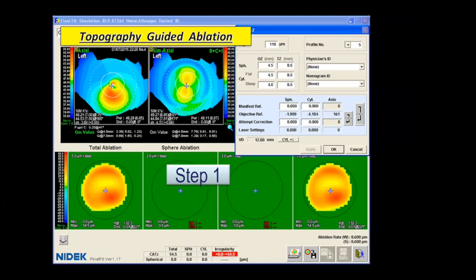But how do you measure it? I mean, before removal of the epithelium, when you see the patient. Yes, before, on the table, on the machine itself, before I even proceed for PTK. Yeah, but after you remove the epithelium with the PTK, you are now applying a profile that was measured from a surface which is different from what you are applying now. So you are applying something irrelevant. It is not much different.